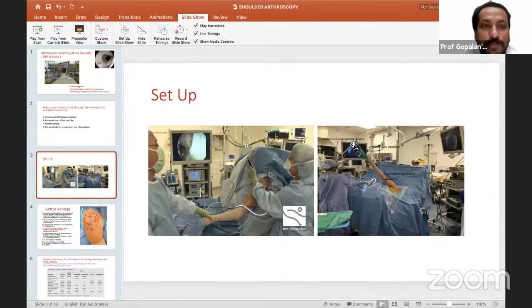And superior capsular reconstruction is again something that's catching on, and you need to place the anchors right on the edge of the glenoid. So I think those are again ones that you can approach via the Neviaser portal, right? Totally true. And again, arthroscopic superior capsular reconstruction is very difficult. It's like doing an arthroscopic latarjet. Even in the UK, unless you are a pure shoulder arthroscopist, not many people do them.